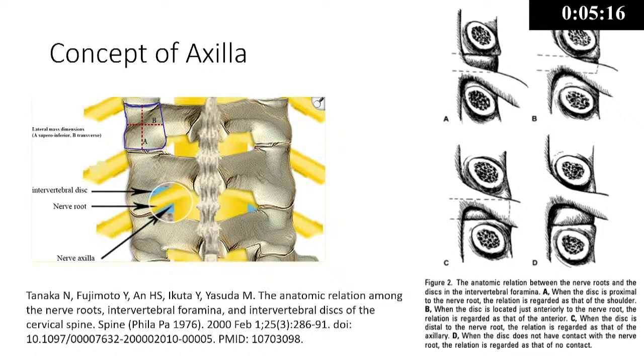And most of the time in the cervical spine, the disc is in the axilla. You will never find a root-shoulder disc in the cervical spine. So most of the time it is in the axilla. If you try to put more traction on the axilla, there are chances of traction injuries and cervical spine injuries. So you have to remove some part of the pedicle, and that is also helpful in the anatomical orientation.